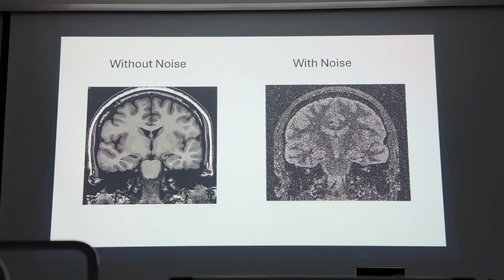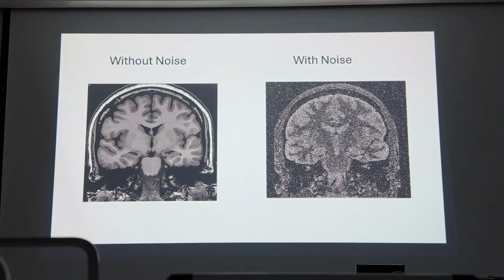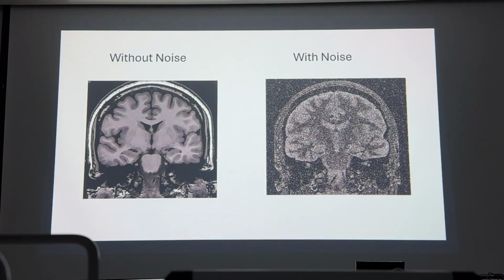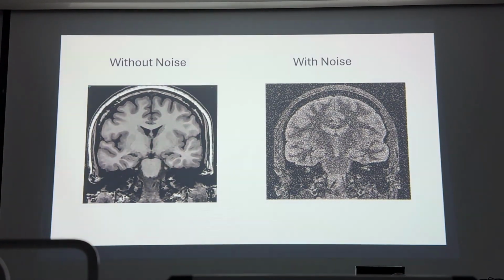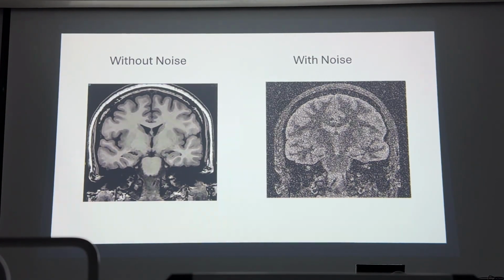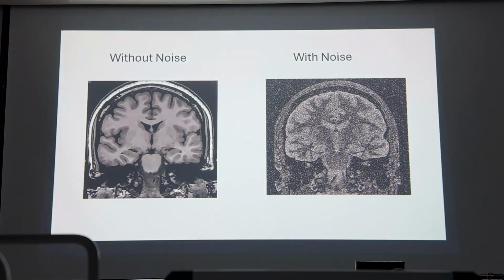Let's now make our definition of the MRI noise. MRI noise is the variation of image detail that comes from interference of RF signal due to random RF energy. This is the definition of noise.